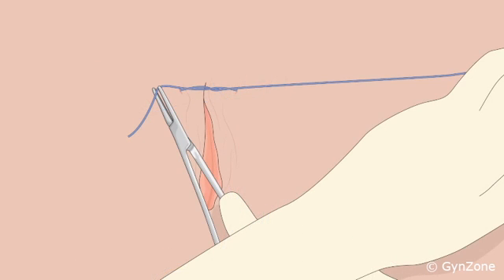The knot is tightened by pulling with equal force on both ends of the thread. Notice that the arms are crossed on the first throw.